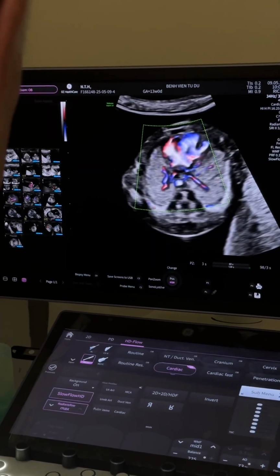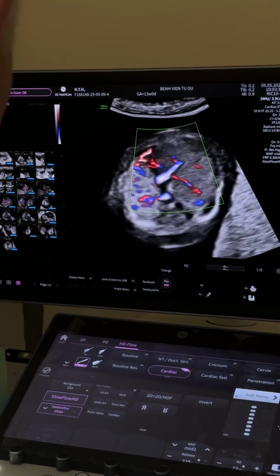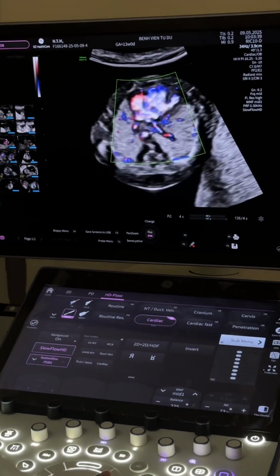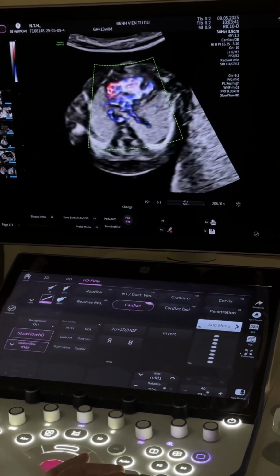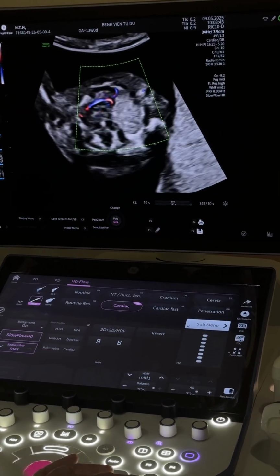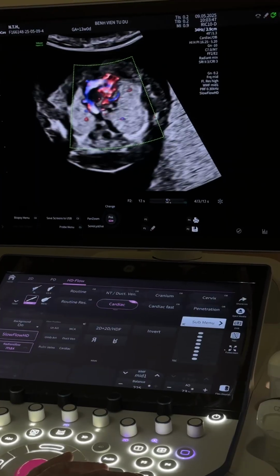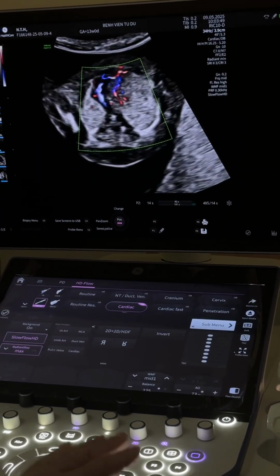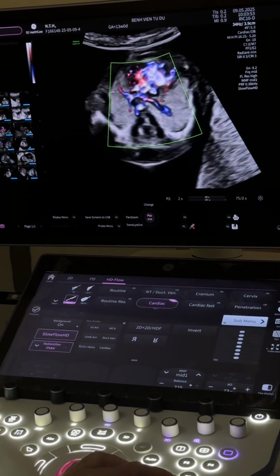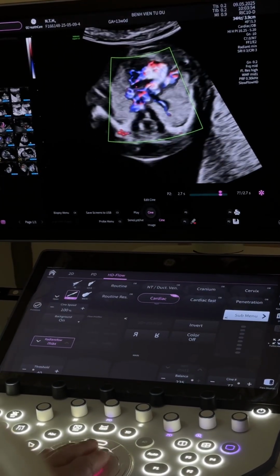So if I look at a single final sweep, I'd start off at the stomach, which looks good. The 4 chamber, I can see there's a central AV canal defect. I can see the pulmonary veins entering normally into the left atrium. As I sweep up to the head and the neck, I can see that there's reverse curvature of the aorta coming out of the right ventricle. And then inferior to that, I'm seeing very, very tiny branch pulmonary arteries.